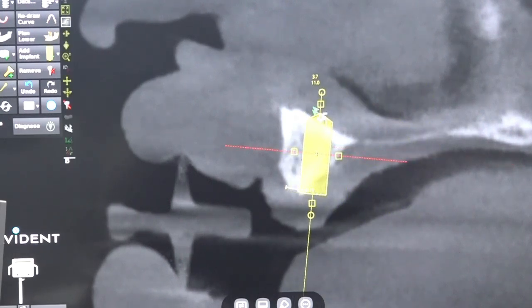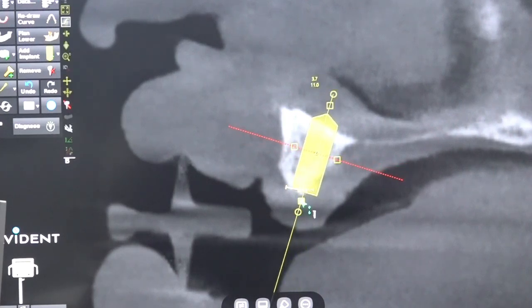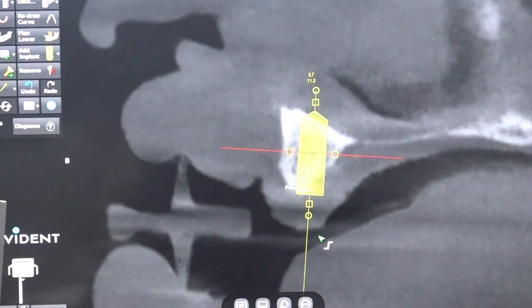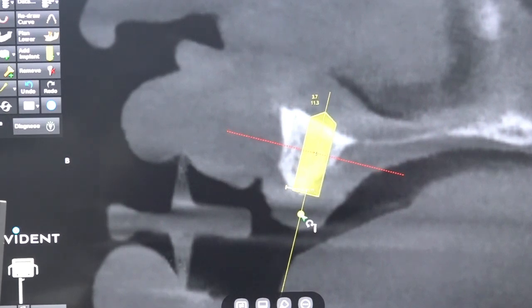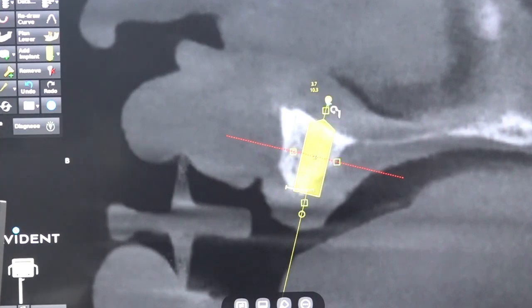So we are going from a palatal approach. Okay, this is the correct palatal approach. We can go towards the labial also, from palatal towards the labial, but you will get the abutment more palatally, which may interfere with the tongue space. So with this small trick we can change the palatal positioning of the multi-unit abutment into labial. Very short implant, thin diameter implant, 10 mm. Here it is only 10 mm.